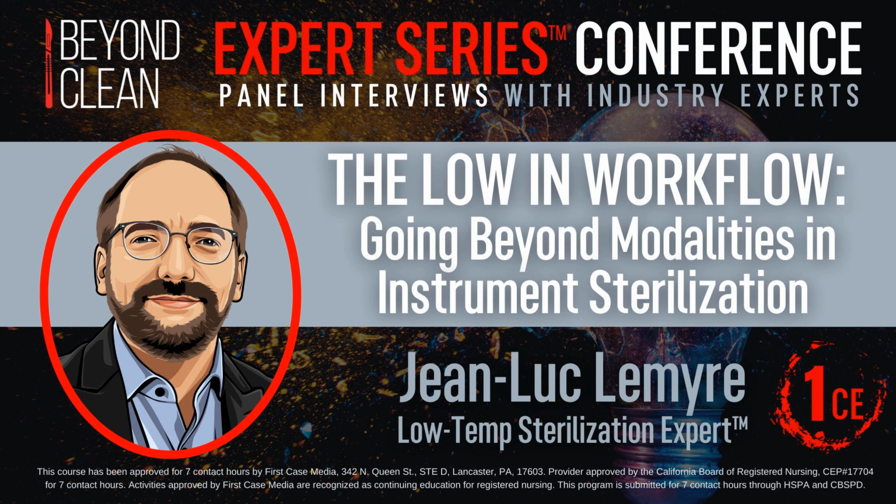Yeah, absolutely. So since we're talking about IFUs, there was a really good question that somebody raised about what they called cross-sterilization, meaning they have some instruments that normally would be sterilized in steam sterilization, but because of circumstances, either that equipment was down or they couldn't wait for the cooling time, they wanted to sterilize it in a different mode using their hydrogen peroxide sterilizer. Is that appropriate to be sterilizing instruments in a different sterilization modality than what you usually do?